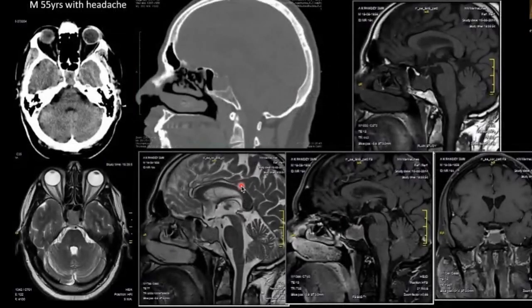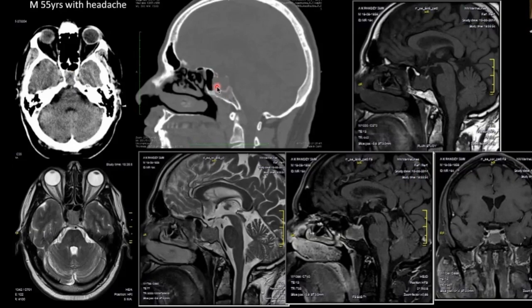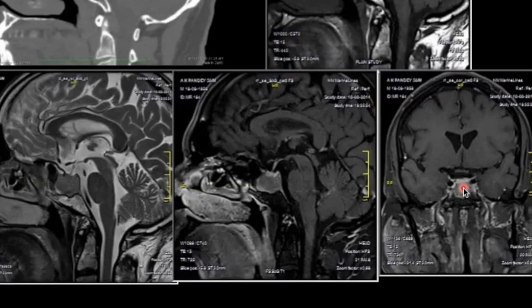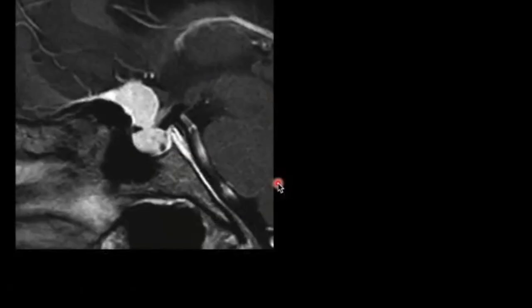Another suprasellar mass is a hypothalamic hamartoma. Now a twist question: a 55-year-old patient with headache had a normal CT except for sella enlargement with slight erosion. MRI showed a mass initially thought to be a macroadenoma. However, the adenohypophysis was seen to enhance separately from the mass, with differential signal on T2-weighted images. This was not an adenoma — it was a sellar meningioma, confirmed by transsphenoidal biopsy.